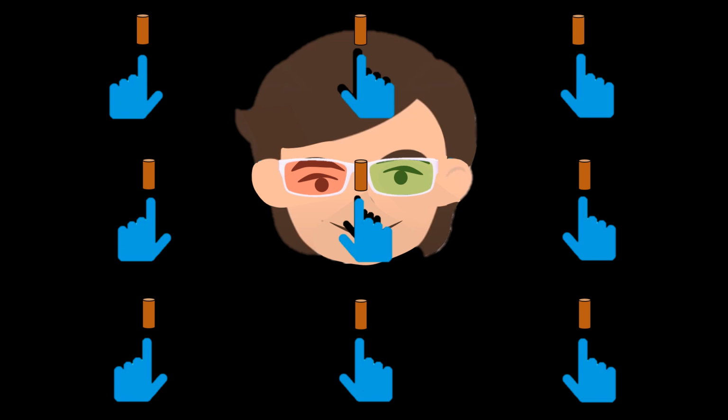On the other hand, unlike patients with normal visual alignment, patients with clinically significant eye misalignment will decouple the right and the left eye images, more or less in one or another direction, depending on the eye and muscle involved and the degree of muscle involvement. The decoupling of images produces bar arrangements with different characteristics dominated by several factors. Number 1, separation. The separation between images may be large or small.